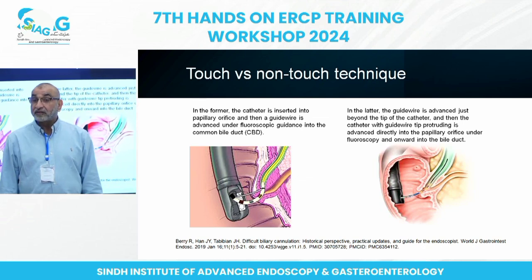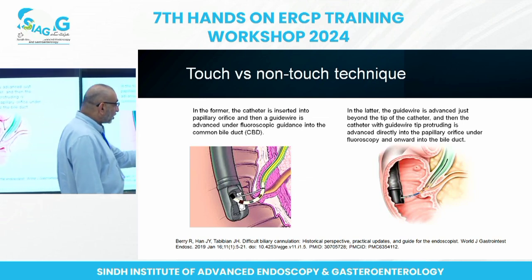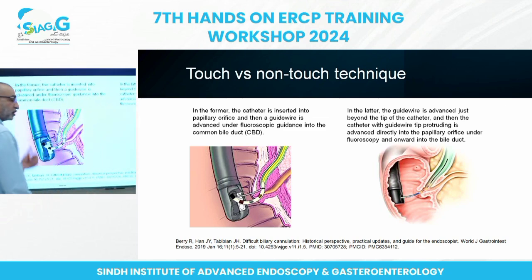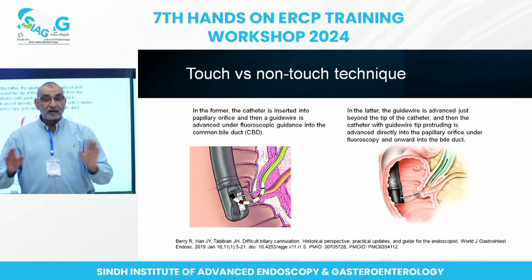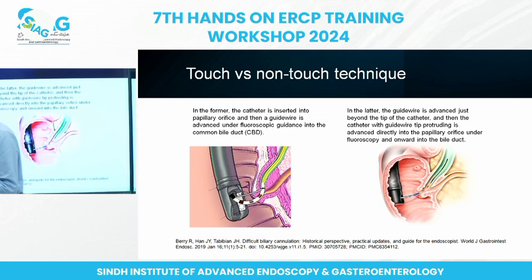But then, having said that, in some of the papillas, if I can't do it like that, I just get the guide wire back to the tip of the cannula and use the touch technique. So it doesn't mean that if you are using the non-touch technique, you should never use the touch. Adjust it according to your needs.